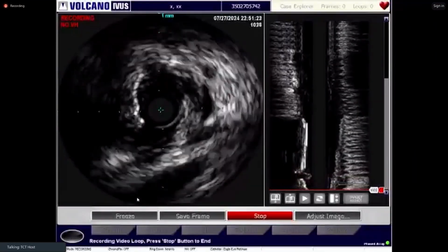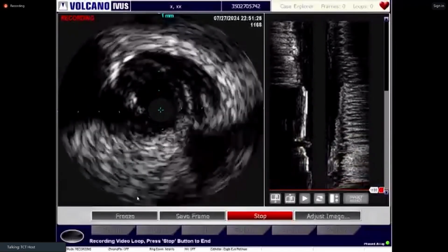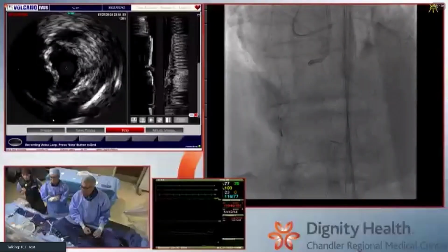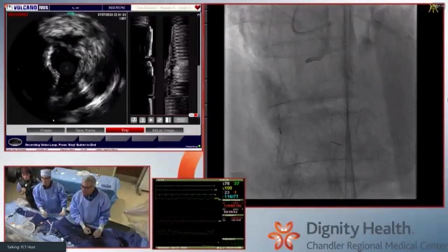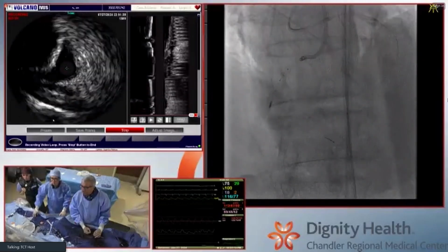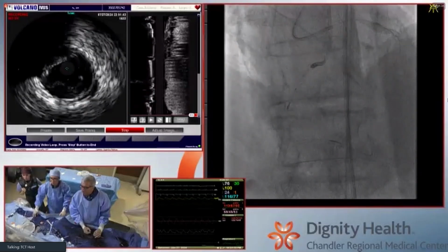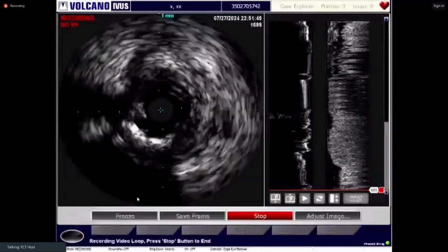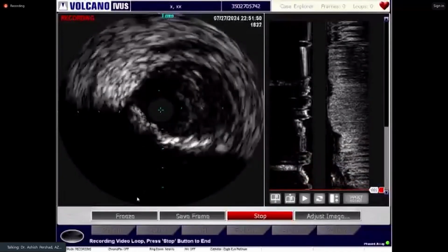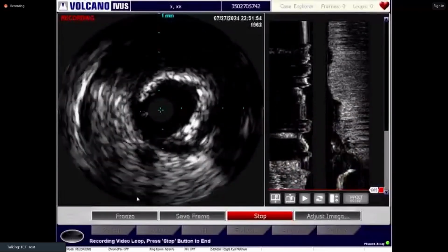Interesting. That looks like intraplaque. That's subintima. Go ahead. That's all subintima. Still subintima. We are intraplaque. Actually, this is the proximal portion of the CTO. And this portion is the proximal vessel. That's dissected, but that's fine. This calcium was not too bad compared to what we thought.